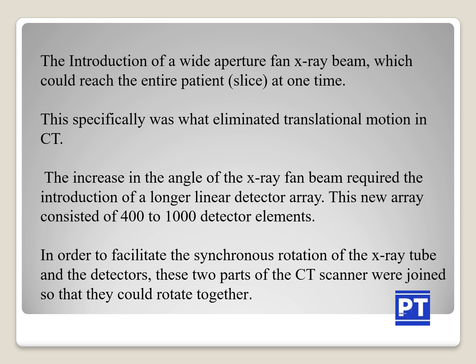The introduction of the wide aperture fan X-ray beam, which would reach the entire patient slice at one time, specifically eliminated translational motion in CT. That means we have eliminated the linear movement. In the case of the third generation, the linear movement has been completely erased.